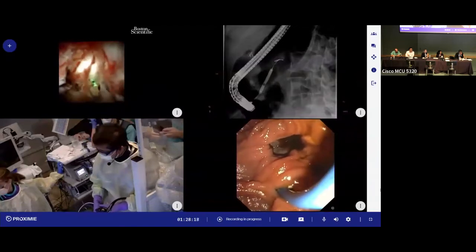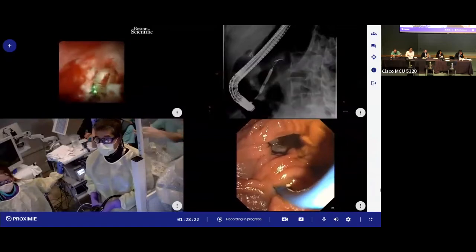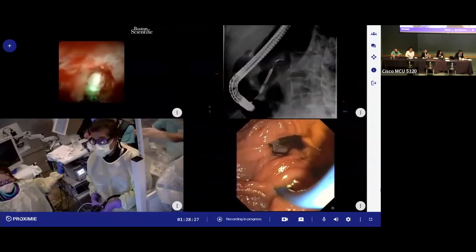The stone busting setting is 1 joule, 12 hertz. I think that's a reasonable start. And that's the main thing I want to show you. I don't know if you want to see this part or go to the EMR.